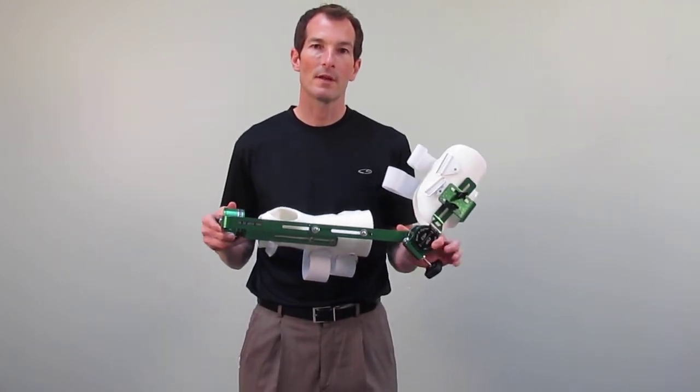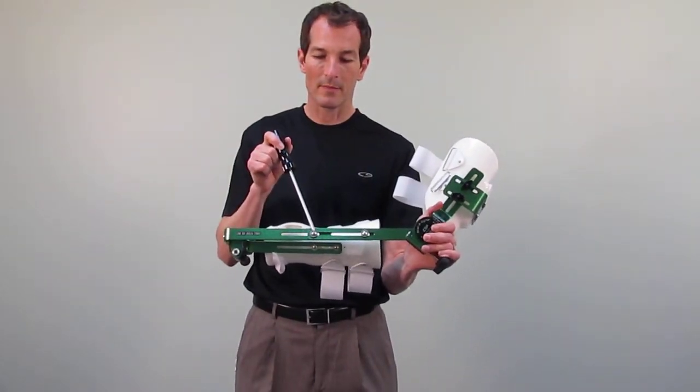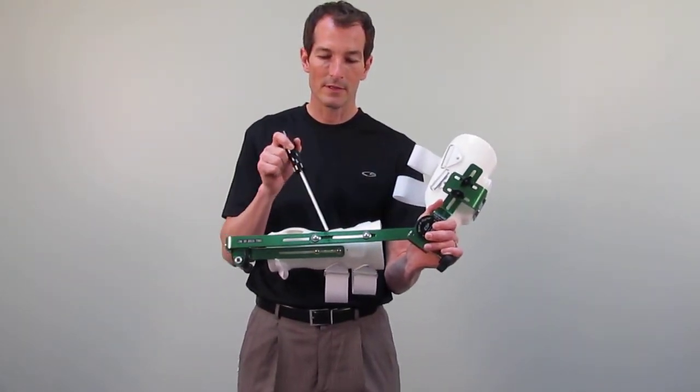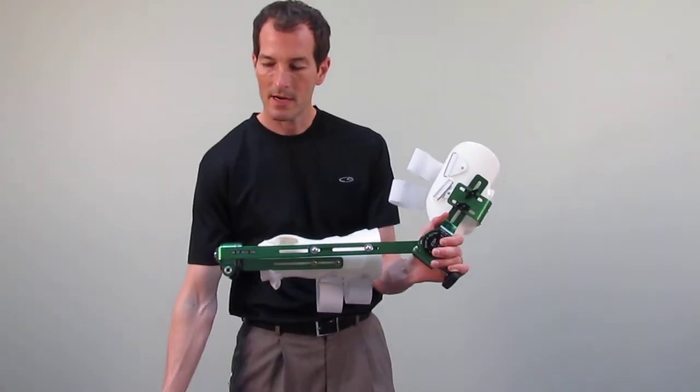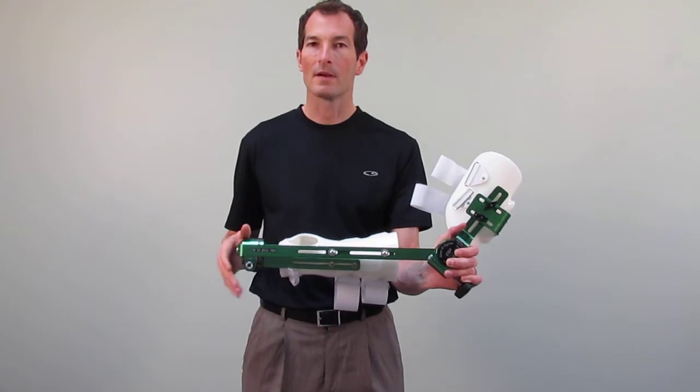First thing that we want to take a look at is to make sure that our forearm cuff fits appropriately from a lever arm standpoint. We can loosen these two Phillips head screws, and this will allow the device to basically retract as well as telescope in a longitudinal fashion.